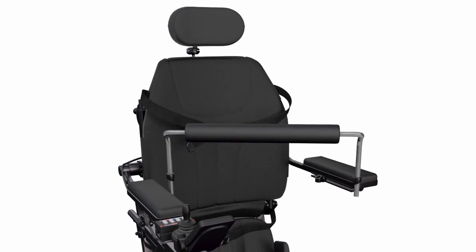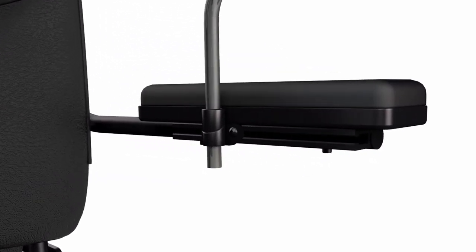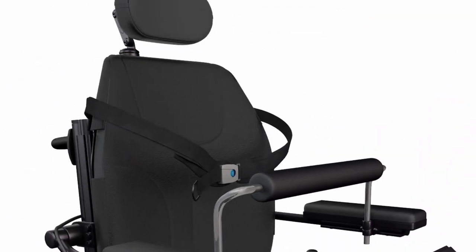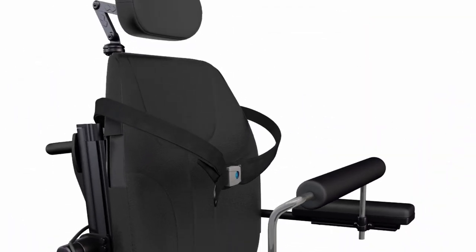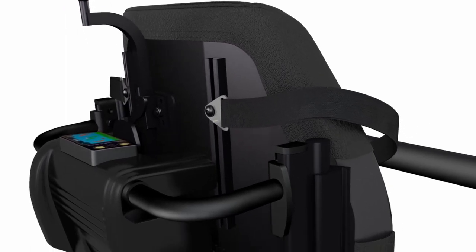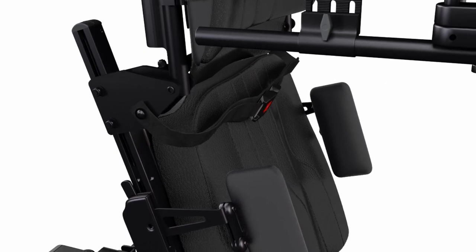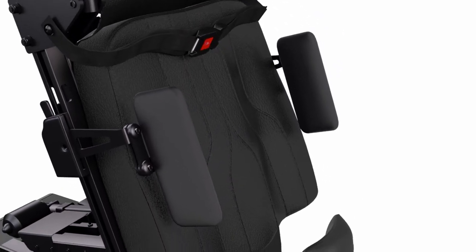The removable chest bar is height and angle adjustable to accommodate user asymmetries. The center pull push-button two-point padded chest strap is height adjustable for anterior and posterior support. The center pull push-button two-point padded lap belt is also adjustable and provides anterior positioning support.